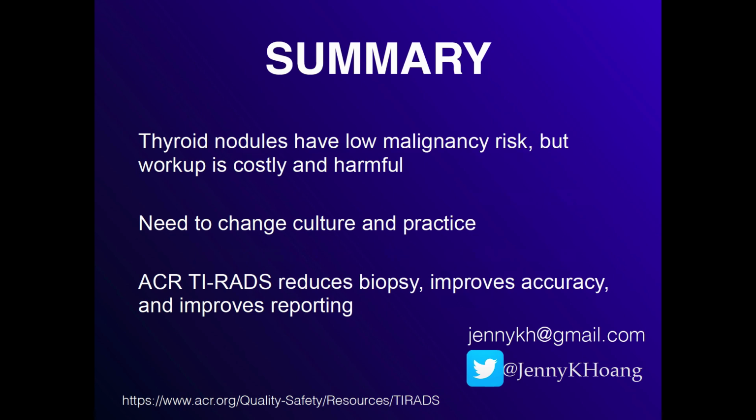thyroid nodules have a very low risk of malignancy, but the workup is costly and harmful for a cancer that is very indolent. We really need to change the culture of how we're doing thyroid ultrasound if we don't want to continue seeing FNA increasing, doubling every 5 years, and thyroid surgery increasing as well. We have to move away from reporting every nodule and biopsying nodules just because of size. ACR TI-RADS makes a significant improvement on what we're currently doing if we actually all adopt it. It reduces the number of biopsies we do, it improves the accuracy, and it improves the quality of our reports.